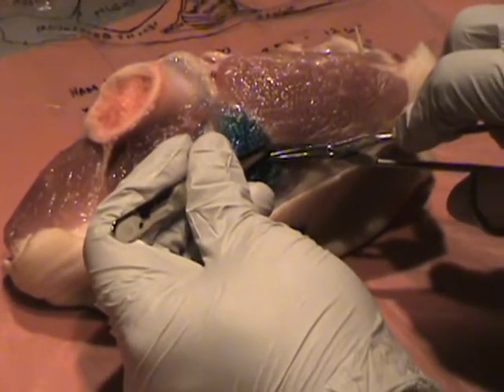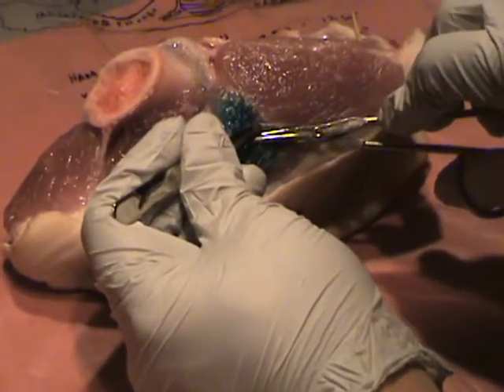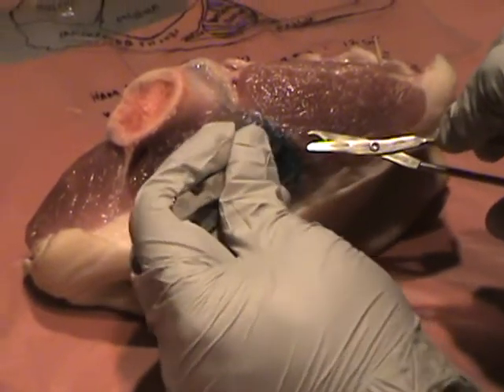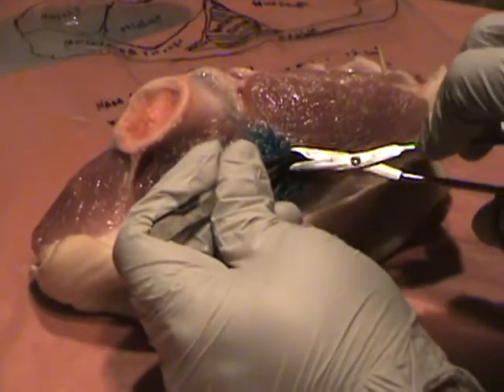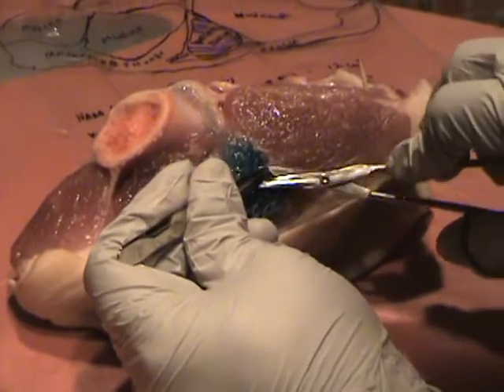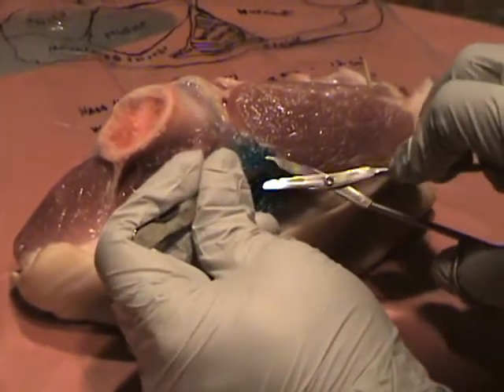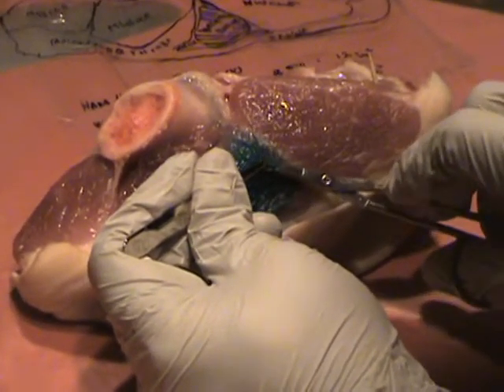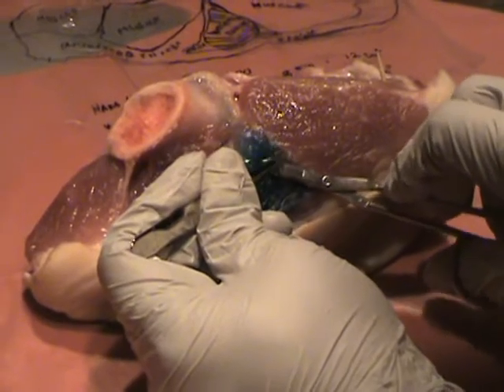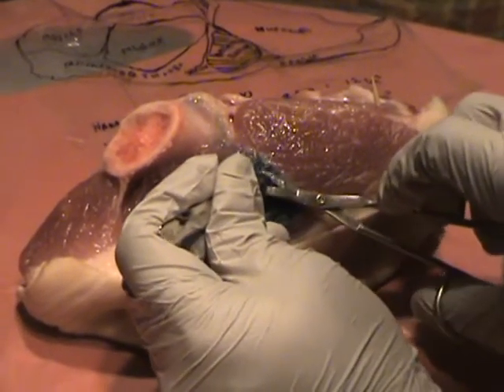I should be resting my forearm on the table, however we have a narrow table over here. And as you can see, I'm sitting down instead of standing up. And the scissors should be parallel to the tissue that we're debriding.